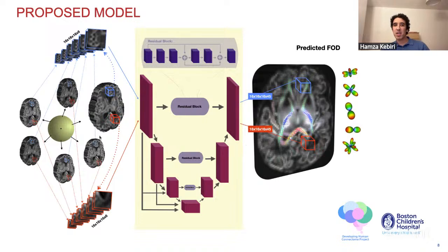One area in which doctors are very helpful to us, because we are not knowledgeable in that sense, is analyzing these FODs or the white matter bundles.